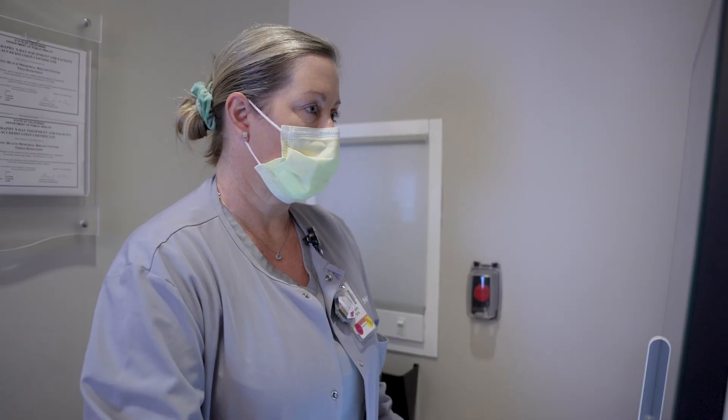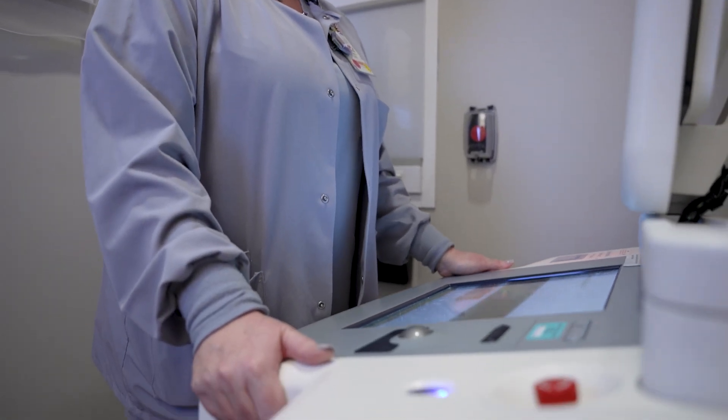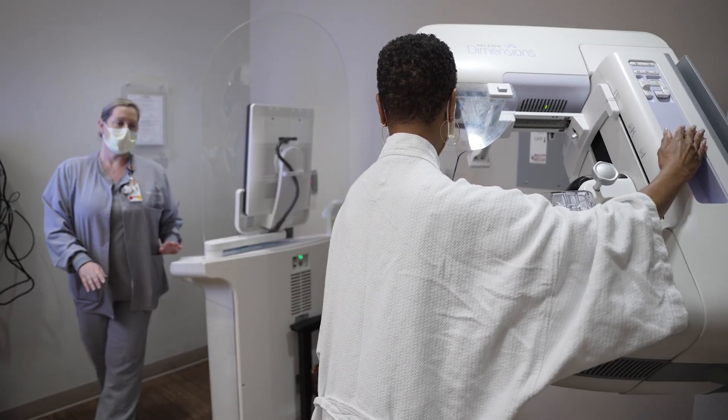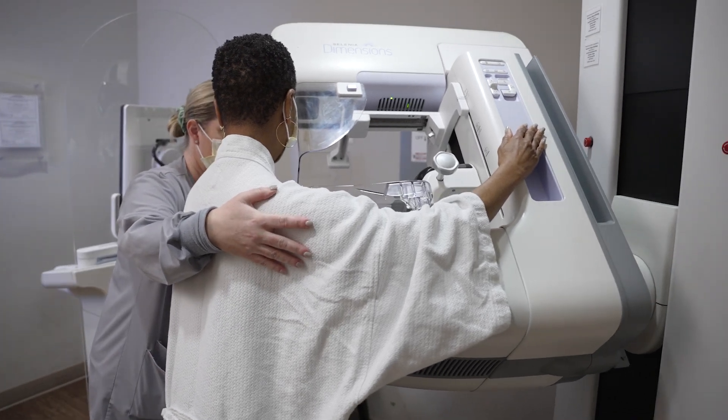Before you leave, you'll be called with your results and any special follow-up recommendations two to four days after the procedure. Occasionally a larger tissue sample is required, and you may need to return for a core biopsy in order to get a definitive diagnosis.